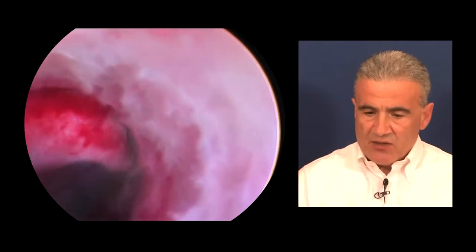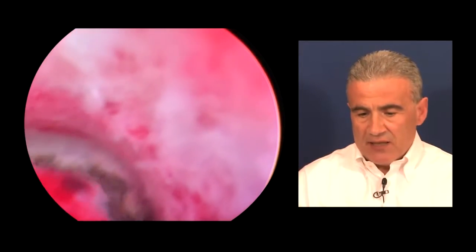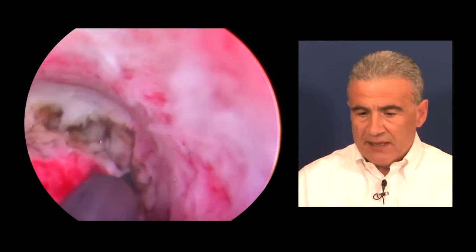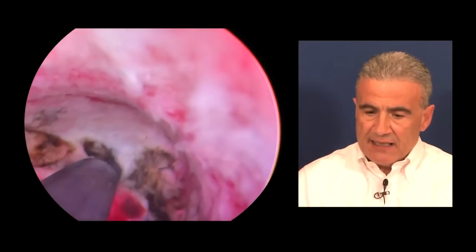In this case, there will also be the advantage of having a complete histological diagnosis on the polyp in its entirety without having to reduce it into small fragments.